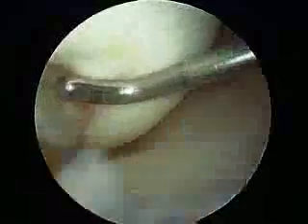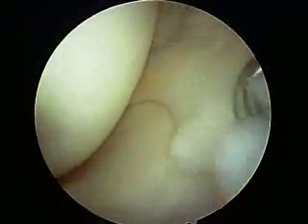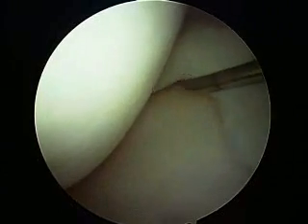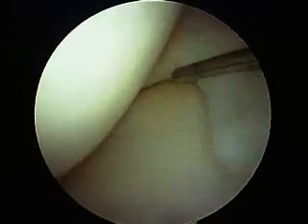Okay, now this is the medial femoral condyle, and that all looks normal. This is the anterior horn of the medial meniscus right there, and that's not torn. This is the mid-third of the medial meniscus, and that looks normal. Let's lift that up, and we can go under there, and if there were a tear in there, the probe would catch. So it doesn't. So now I'm going to look at the posterior horn.